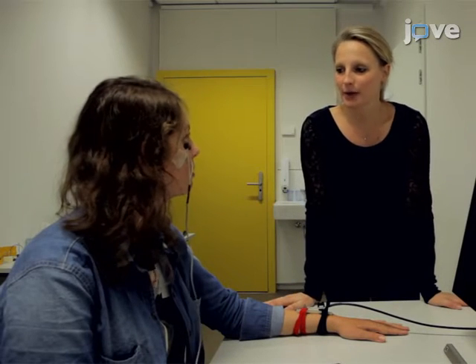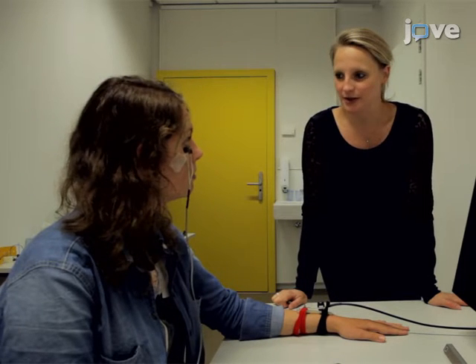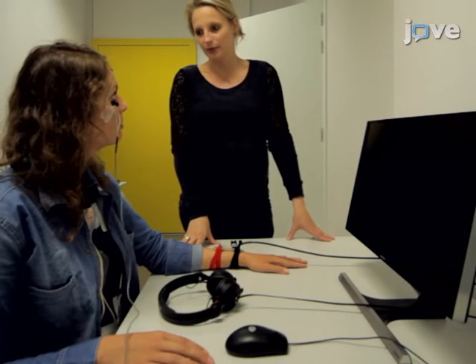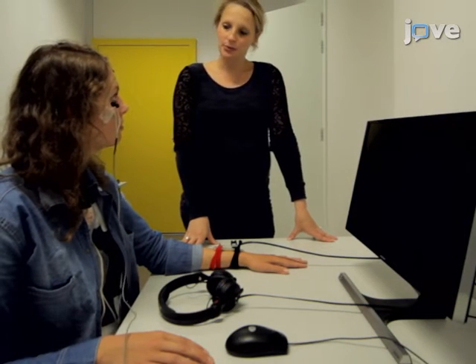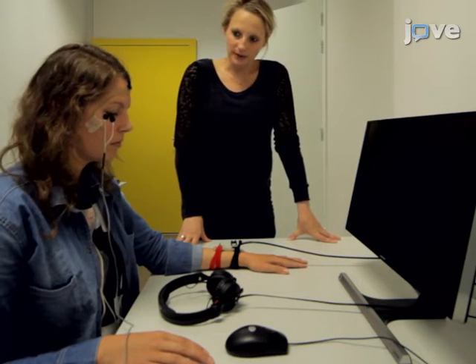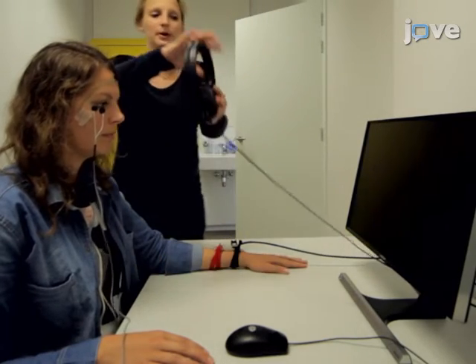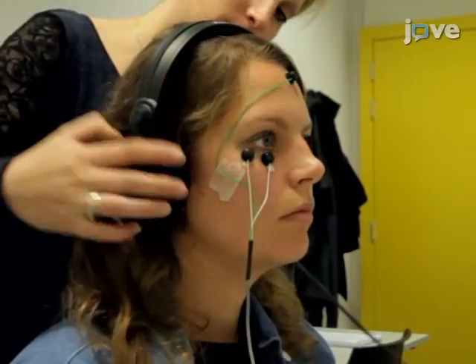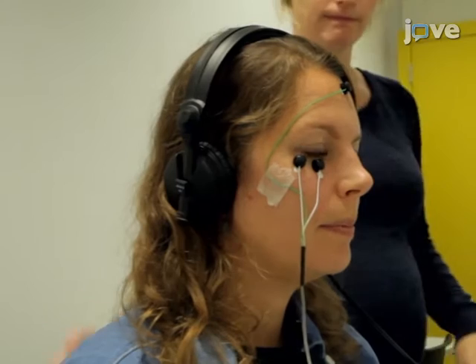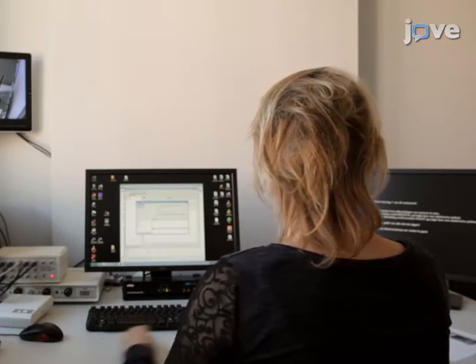Inform the participant regarding the pictures. Instruct them to monitor the relationship between the pictures they are seeing and the delivery of a shock. Instruct the participant to report the expectancy of an electric shock during testing by shifting a cursor on continuous rating scales. Direct the participant to keep their eyes on the screen and sit as still as possible. Hand them headphones to wear during testing. Dim the lights and shut the door after exiting.